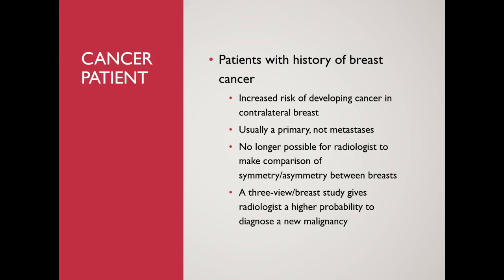A 3-view breast study gives the radiologist a higher probability to diagnose a new malignancy. So if you do have a patient come in that is a prior breast cancer patient, then you want to think about giving the radiologist an extra view. In addition to the CC and the MLO, it may be required to do a mediolateral view or an exaggerated CC view. It's just going to depend on the patient.